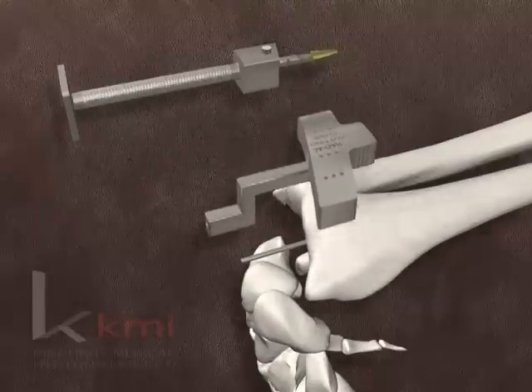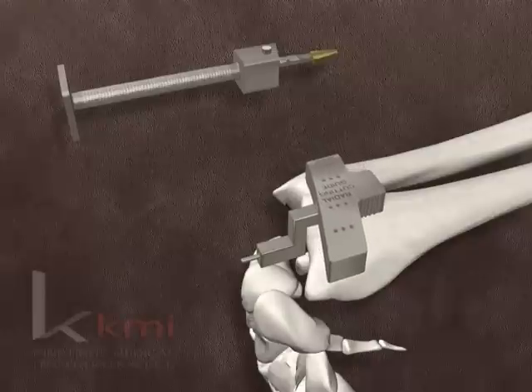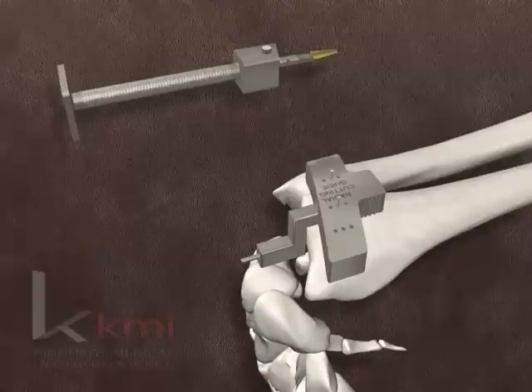The radial guide bar is slid over the rod until it abuts the radius. The radial cutting guide block is mounted onto the guide bar and slid into proper position. It is positioned to guide the saw cut just beneath the articular surface. While the curved undersurface of the cutting block is held aligned with the dorsal surface of the radius, two or three 1.1 mm K-wires are inserted through the holes in the cutting block and drilled into the distal radius. The K-wires are cut a few millimeters above the cutting block.